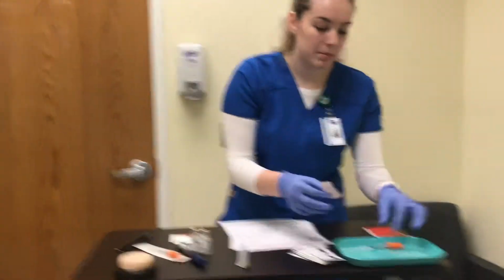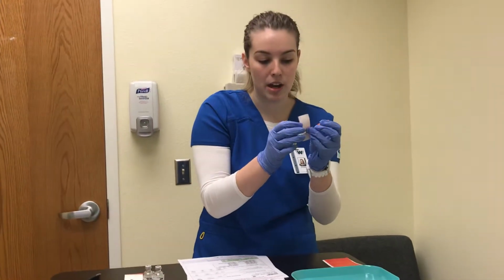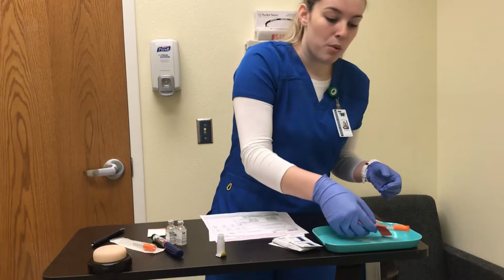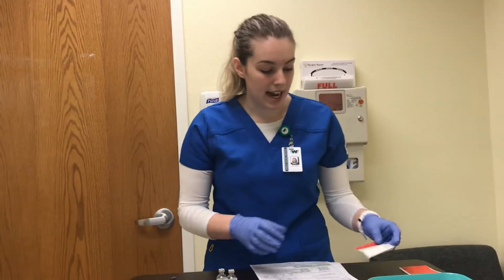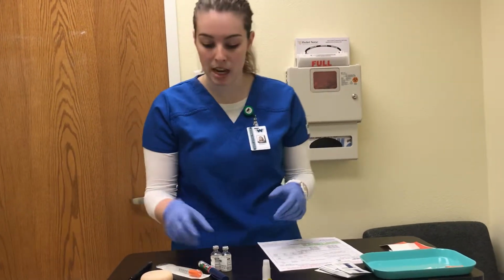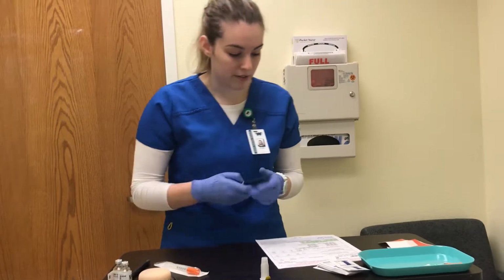Okay, so now I'm just going to put this onto my needle for when I do my third medication check and know how many units I have to give my patient. And while I was on my way back to the med room to prepare her insulin, I actually saw that my patient's supper trays were going down the hallway, so by the time I get there, I know that she will have her supper in front of her and ready.